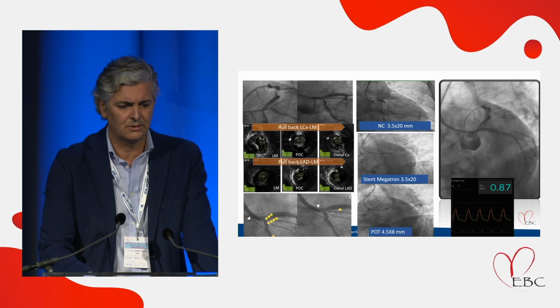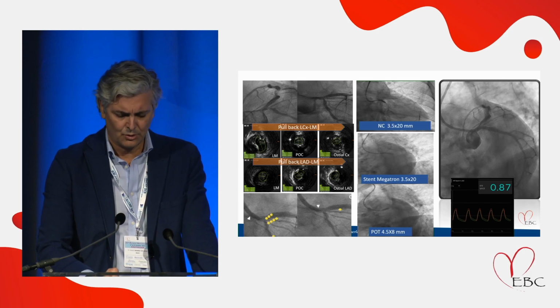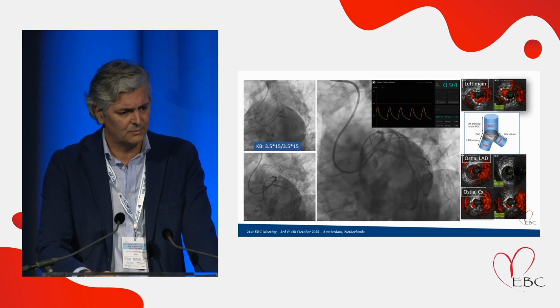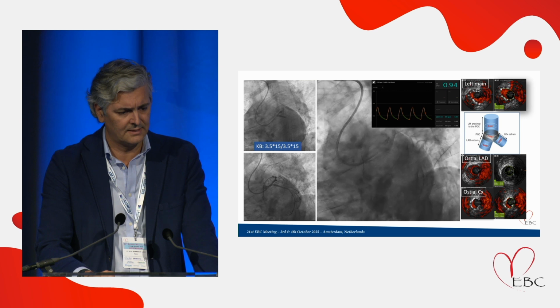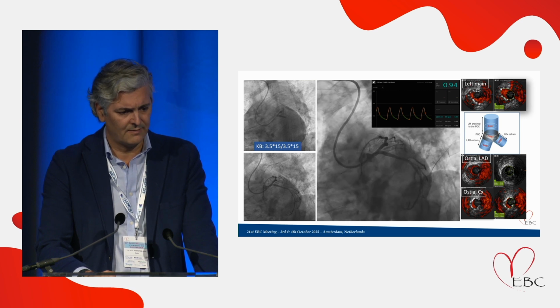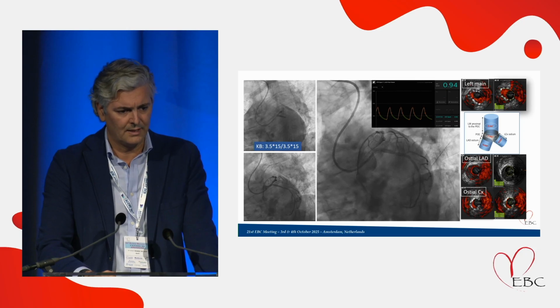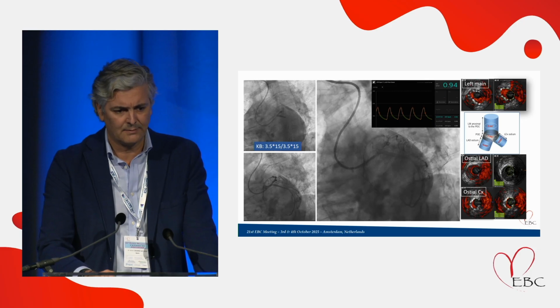Excellent result in the stented segment and a mild stenosis in the ostium of the LAD. We assessed with physiology with an iFR of 0.87. So we finished the procedure with a kissing balloon, with the diameters adjusted to the reference of the LAD and circumflex. And here we have the final angiographic result with normalization of the iFR, of the physiological index, and good areas in terms of expansion.